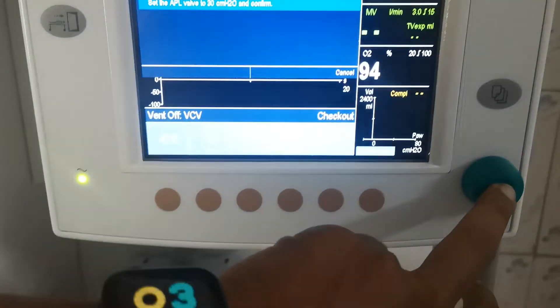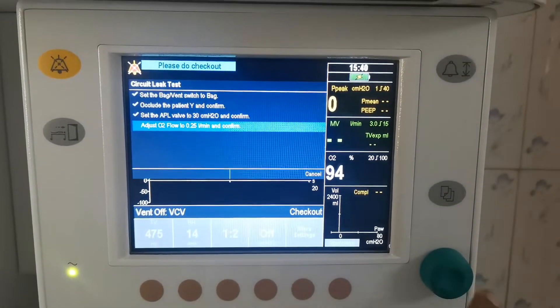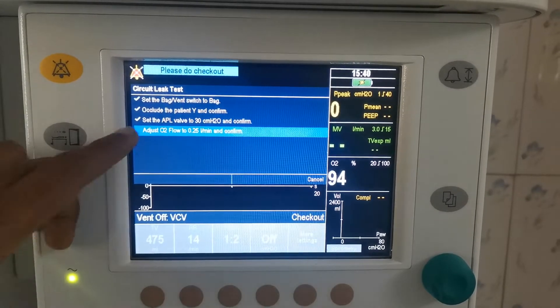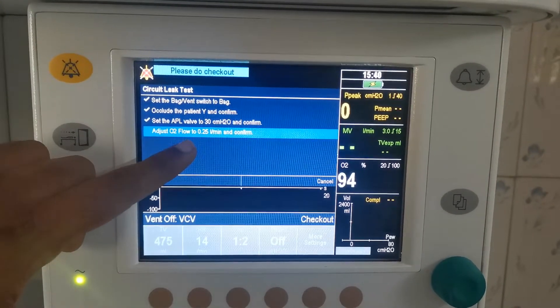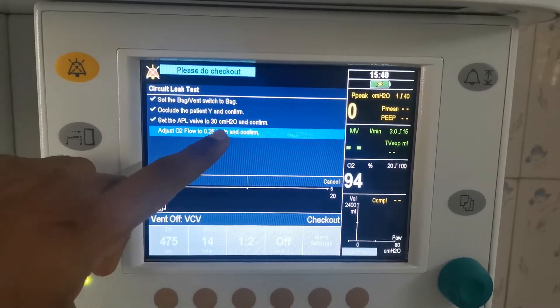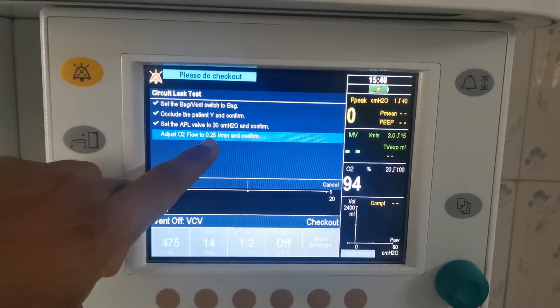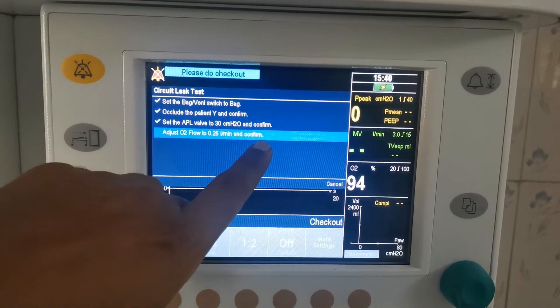And you press the button. Confirm. That is done. Then adjust the flow to 0.25 liters per minute and confirm.